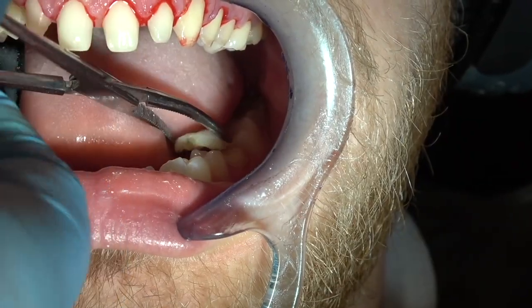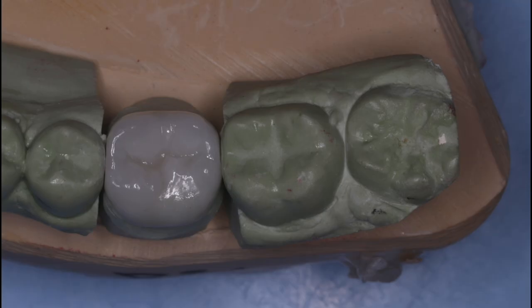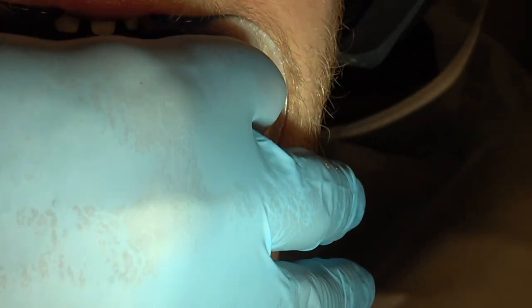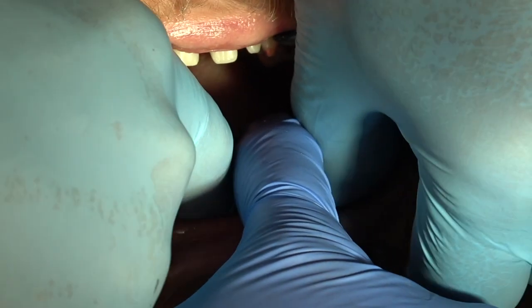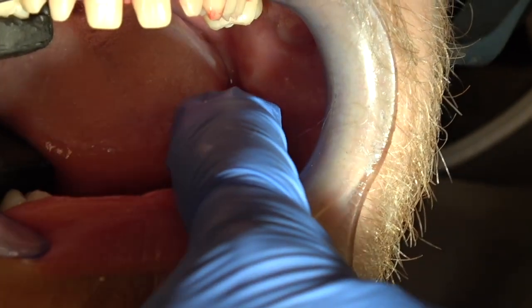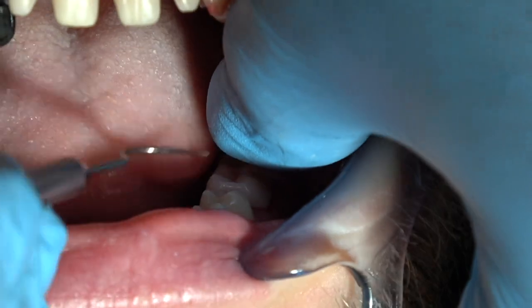And this is the molar tooth where we performed endodontics, and a crown. There's the crown. I'm going to try that in first. And you use the solid model to perfect the interproximal contact. I'm going to check that with unwaxed floss. My assistant's putting her finger on the crown to hold it down as I check the interproximal contacts. Those are very good. Checking the margins with an explorer. Now, if you've got any question, you take a radiograph of the margin of the crown.